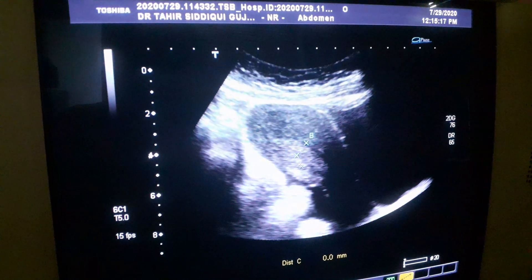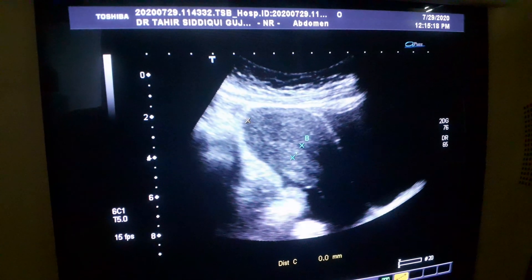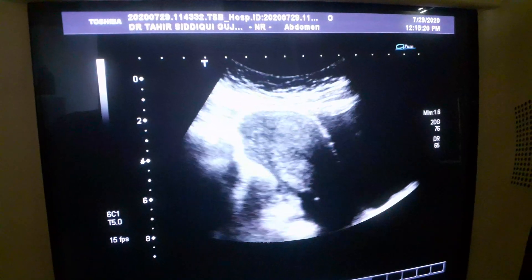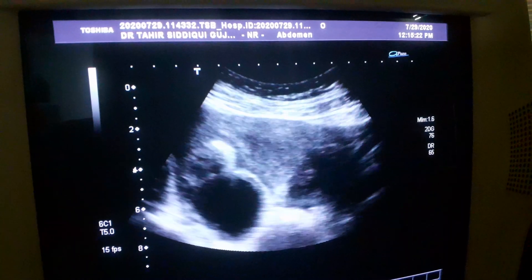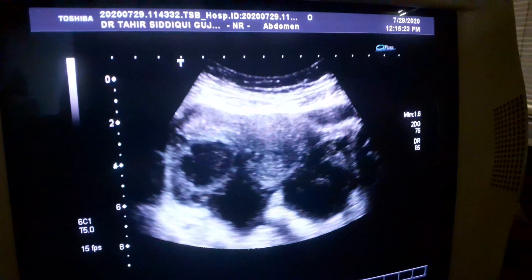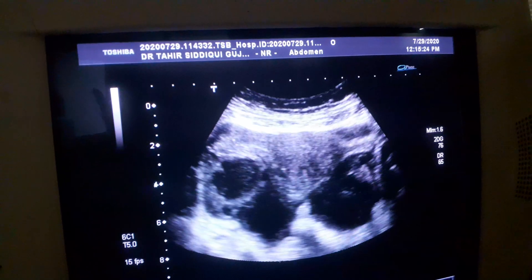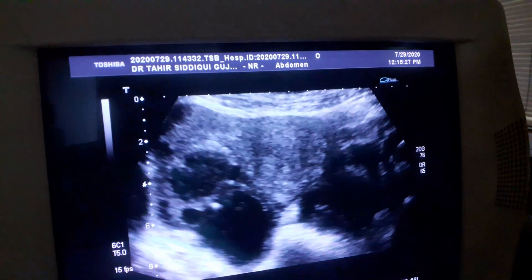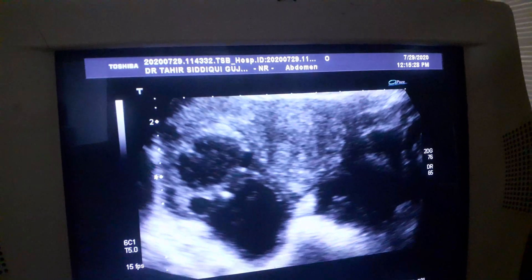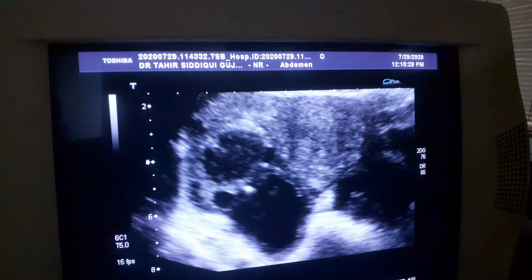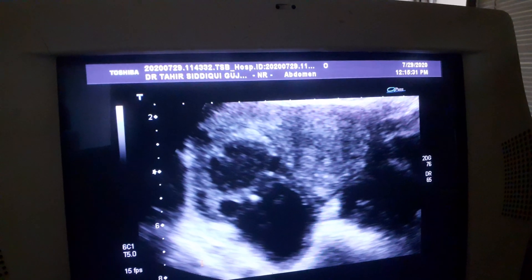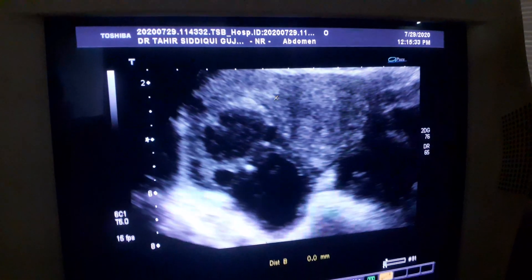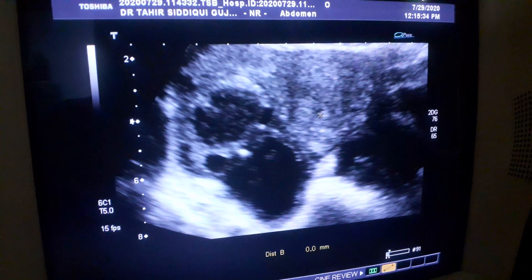This is the myometrium, myometrial mass. This is the longitudinal view as I move transversely. The cause of her infertility is in front of you very clearly. This is the uterus in transverse section.